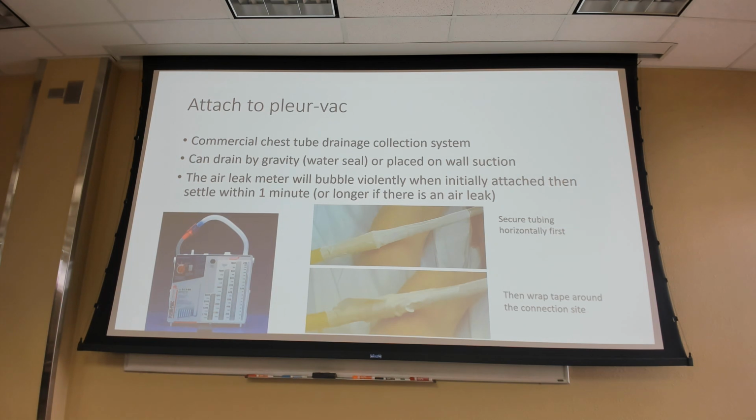And then you have to obviously attach your Pleur-evac to the chest tube. Most of them come with what we call a little Christmas tree, which is like a little step-up valve to accommodate multiple sizes of tubes. So you need to make sure you have that with you. Some of those chest tube kits that you can order for your units, they may not come with them. So you need to consider that and inventory and inspect your equipment and learn how to use it preferably prior to performing the chest tube. But there are different types of systems, so you need to pay attention to that.